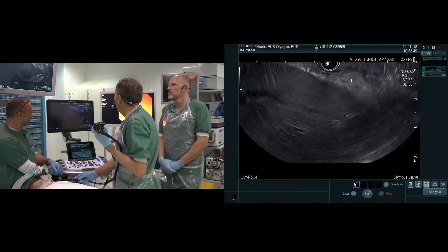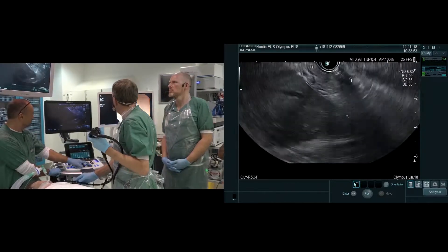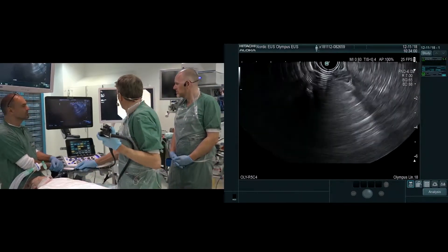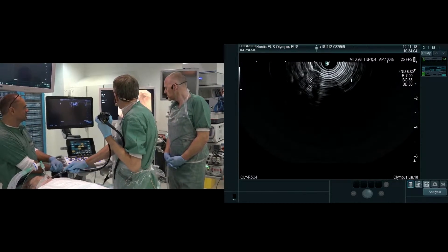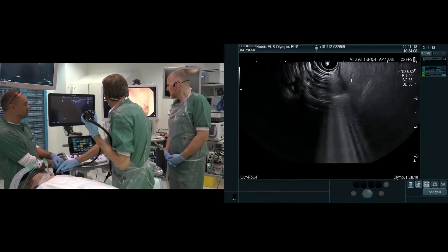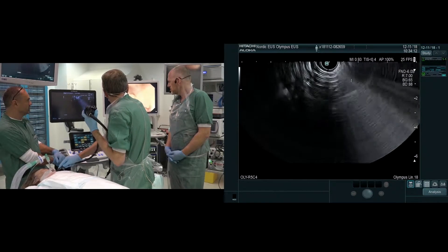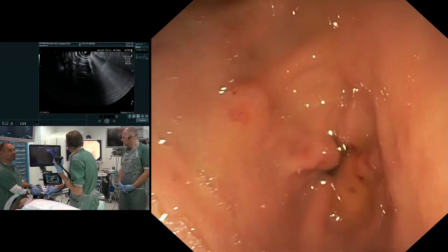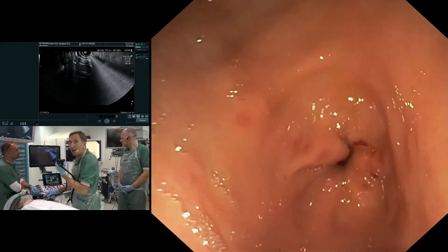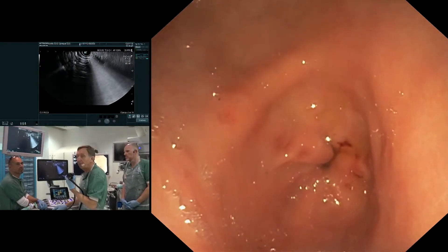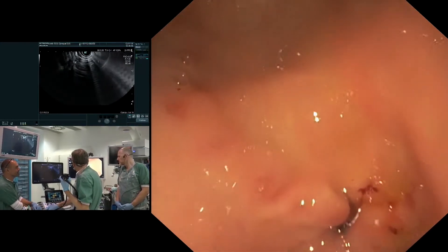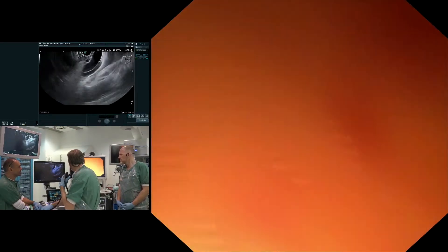The next step will be to look at the view from the duodenum. For the passage into the duodenum, I have to fill air in the stomach and go downwards. You will see the pylorus — there it is. There are some small erosions in the antrum. Can we see the endoscopic image as well? There are only a few situations where we want to see the endoscopic image, and this is one of them. So this is the pylorus with some erosions — a little bit of gastritis. I pass through the pylorus and move downwards into the duodenum.